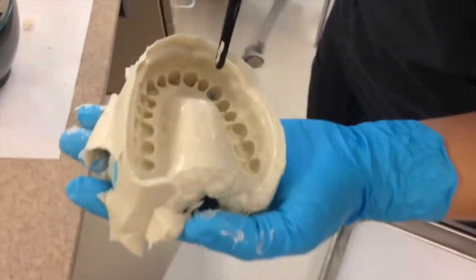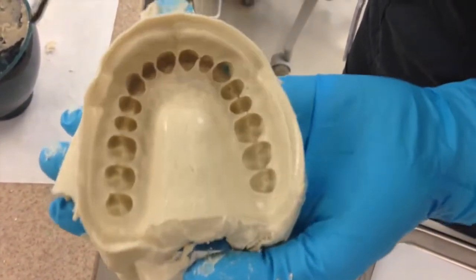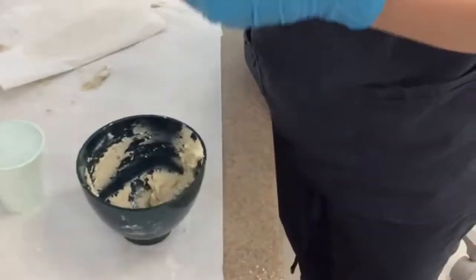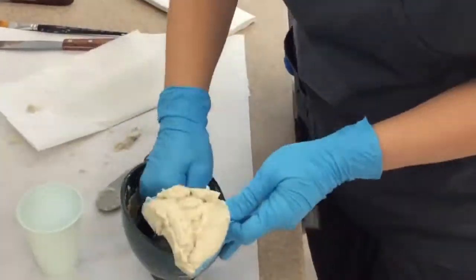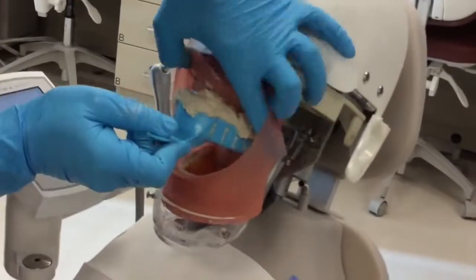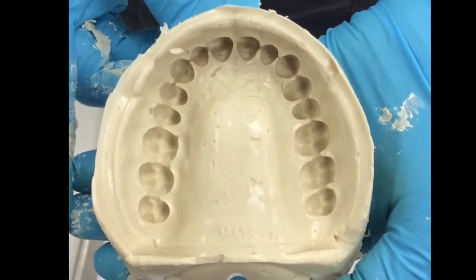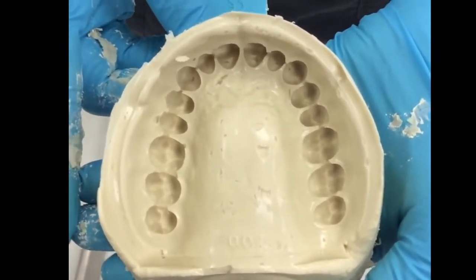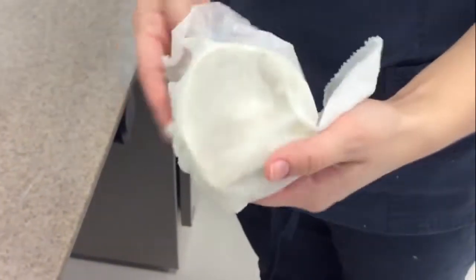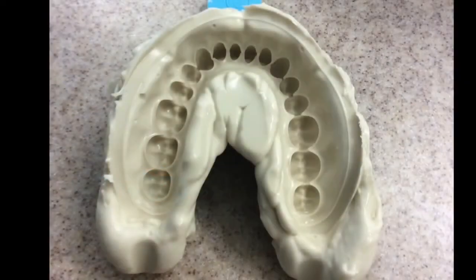Now let's look at the impression. Are there any tray areas showing through? Do you see the full vestibule? Are there any areas missing? If so, we'll need to do it all over again — hopefully a little faster this time. That looks perfect. Now you'll want to gently wrap it in a damp paper towel. If we had a real patient, you would need to disinfect this impression. But since Darwin doesn't have any normal flora, you can skip that step. You'll repeat the process for the other impression.